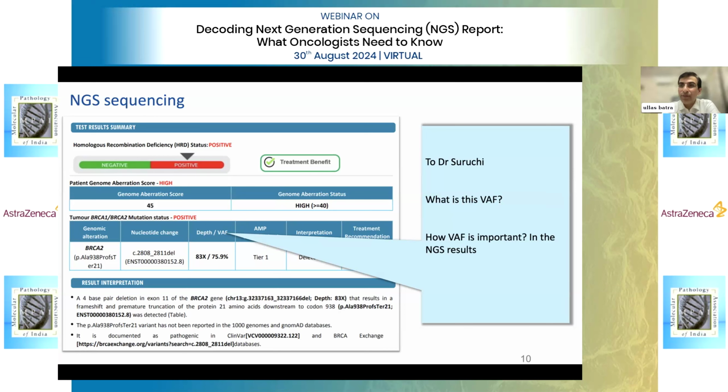The common fallacy medical oncologists have is thinking it is 25 of 25 EGFR, or EGFR plus ALK plus ROS plus whatever. That is not really the case. That's what I initially thought. It's the number of abnormal reads divided by the total number of reads at that gene position, and it will vary from sample to sample. It is a very sample-specific parameter. It is not like minor allele frequency, which is a population database frequency. It is for that particular position in this report.